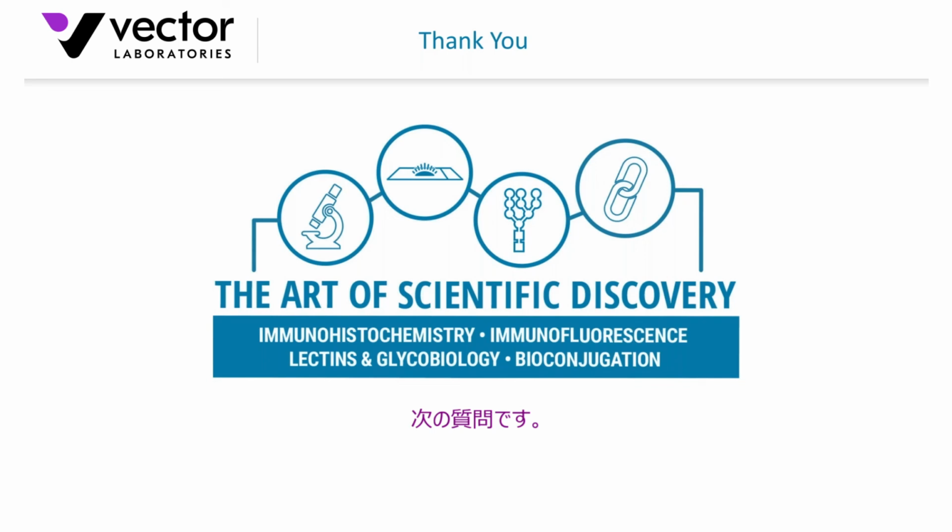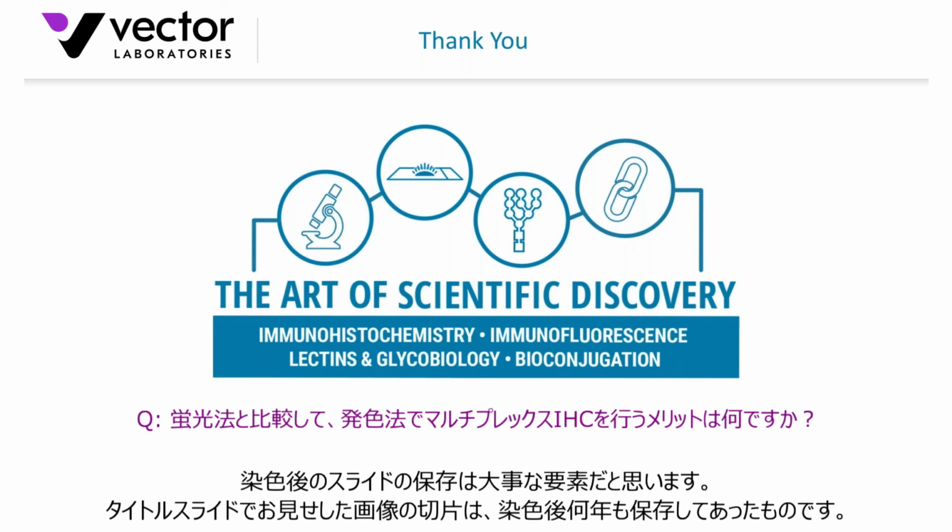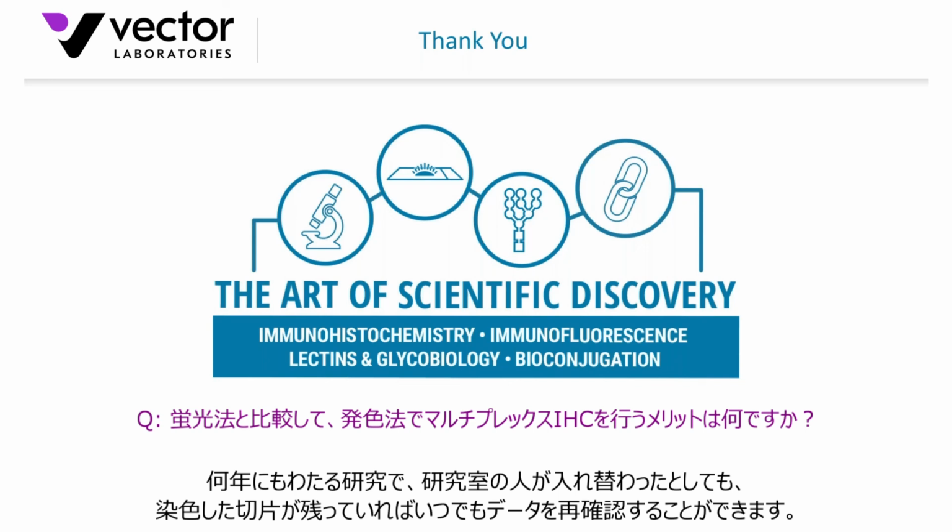Okay, the next question is, what is the benefit of chromogenic multiplex IHC versus fluorescent multiplex IHC? Yeah, fair enough. I would say archiving would be pretty key. I think that title slide, we've had that for years. You can go back and revisit that.